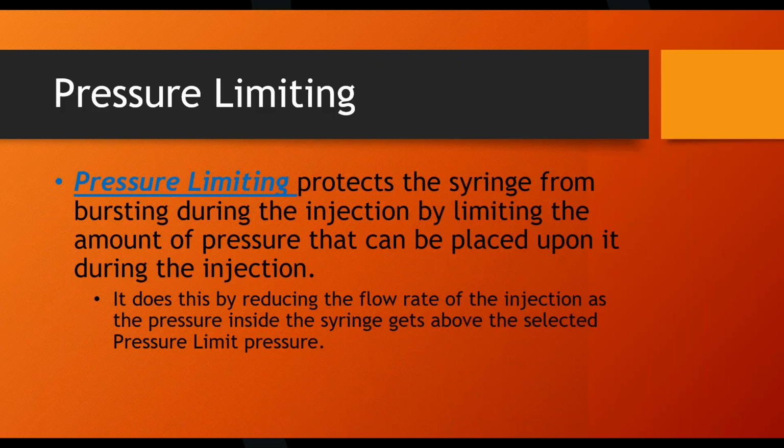All the fluid we fired in the patient was for nothing. So what the injector does is, instead of just stopping, it slows down, backs off on the flow rate, right? So we're doing a flow rate of 5 milliliters per second and we hit 300 PSI and the system senses that. What it'll do is slow down a little bit. Maybe a flow rate of 4.8 milliliters per second is enough to get this done. It might be indiscernible on the image, all right? All we know is if the injector stops, we definitely have to do it over again. We might have to do this over again anyway, but if we stop, we definitely have to. If we let it finish its shot, we might still have a good shot. So that's why the injector doesn't stop the injection, it just slows down.